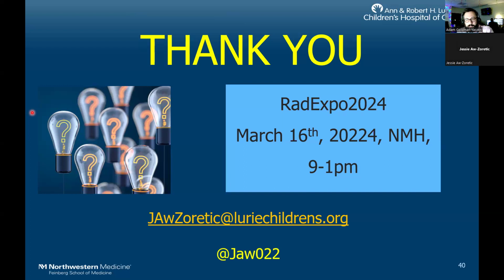There's a lot of things that can go wrong with the ASL. So, making sure you're interpreting it correctly in the appropriate setting, and making sure the technique at your institution is validated and stuff like that. So it's hard. But Usha said they needed to make time for the MR spectroscopy. That's true. We only have so much time.